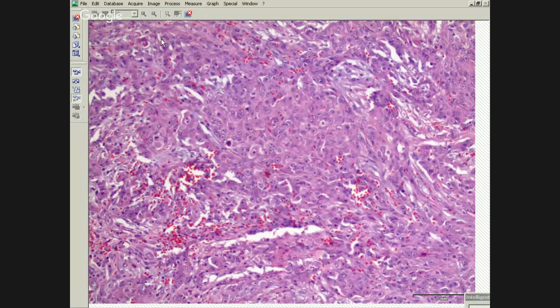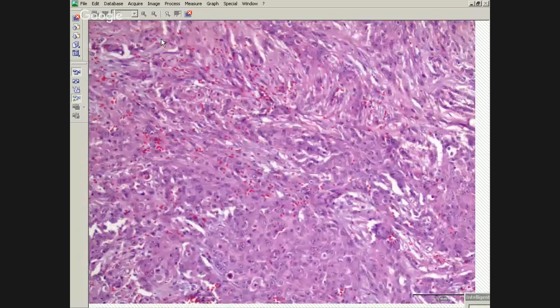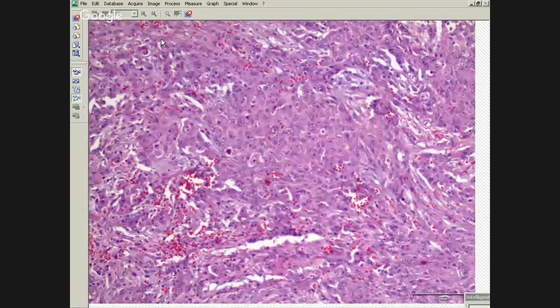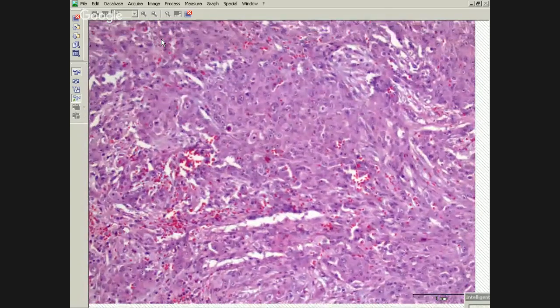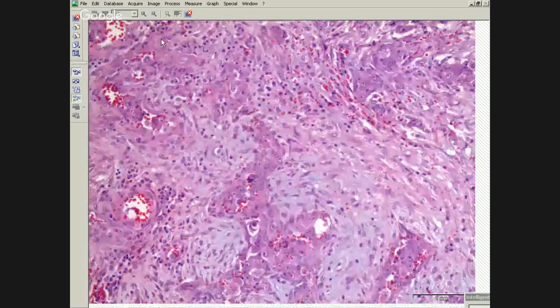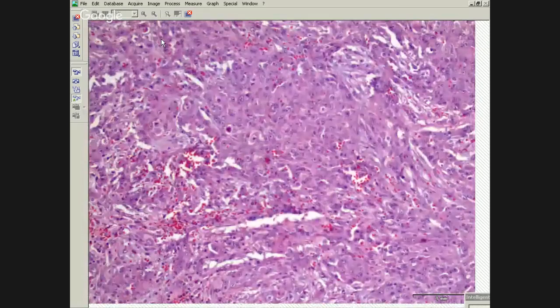Okay, what do you want to get before your calretinin? Remember I told you this is not the place to be cheap. Keratin. Okay, you want to get a keratin. Your keratin here is negative. Okay. Now what are you thinking? So still we can do a calretinin.